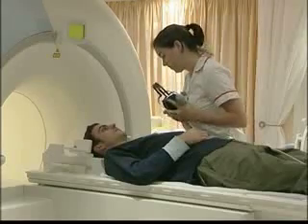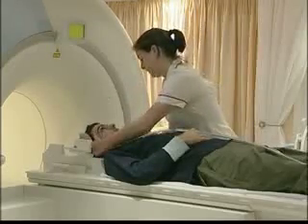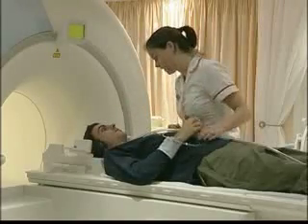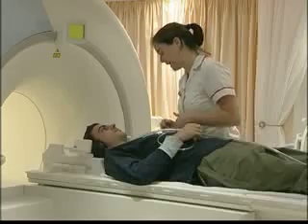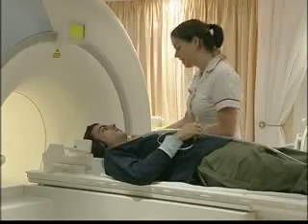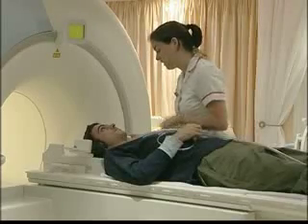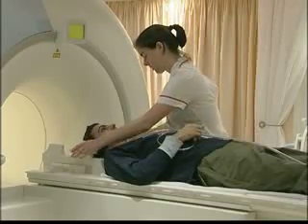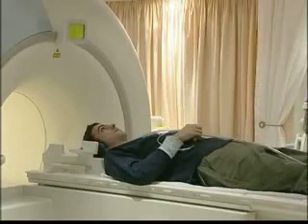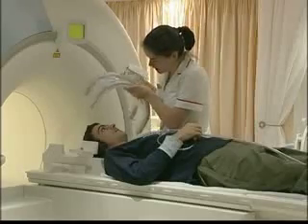To obtain images, the patient is placed in a large, static magnetic field produced by a superconducting magnet. This powerful field, typically 1.5 Teslas in strength, causes the nuclei of the hydrogen atoms in the body to line up. But they can also be flipped into another direction by a radiofrequency pulse. The way these nuclei then relax back to their original position depends on the environment of the hydrogen atoms — in other words, on tissue type.